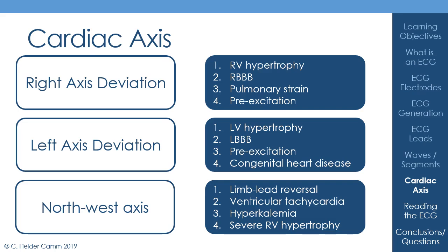But actually the most common cause for it is that the person recording the ECG has accidentally put the left and right arm leads on the wrong way around. And so if you go and see the patient and they look very well, the first thing I would do is ask for another ECG, and I would just ask whoever is doing it, or do it yourself, to very kindly just check that those arm leads are on the correct way around.